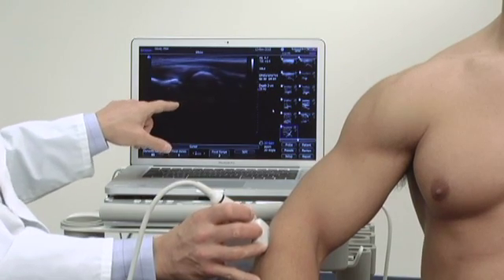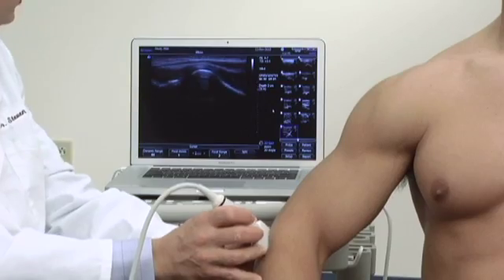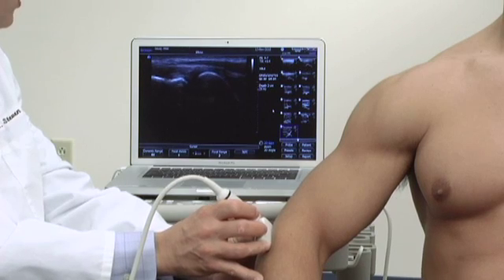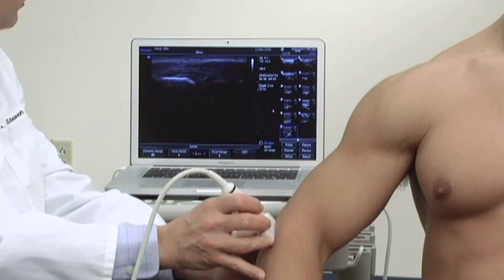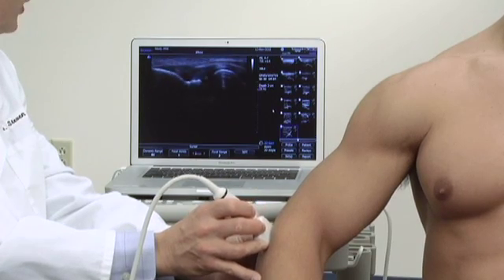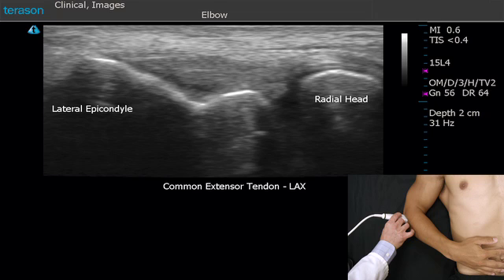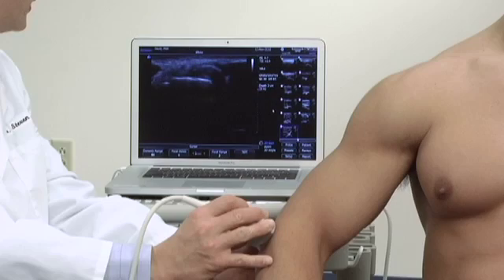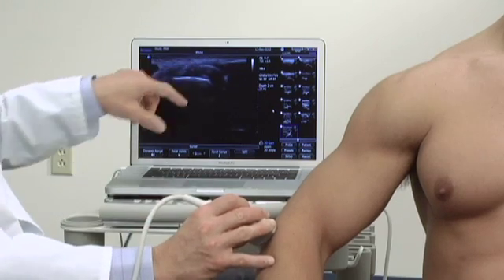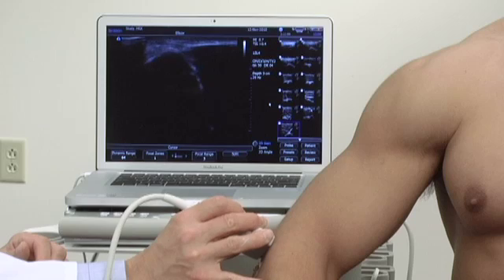Deep to that would be the radial collateral ligament, which can be very difficult to separate from the common extensor tendon. To examine the full extent of the tendon, we'll move the probe a little more medially or anteriorly, and laterally or slightly posteriorly, to see the full extent of the tendon in the long axis. We can also look at this tendon in its short axis and follow it all the way to where it inserts upon the bone.